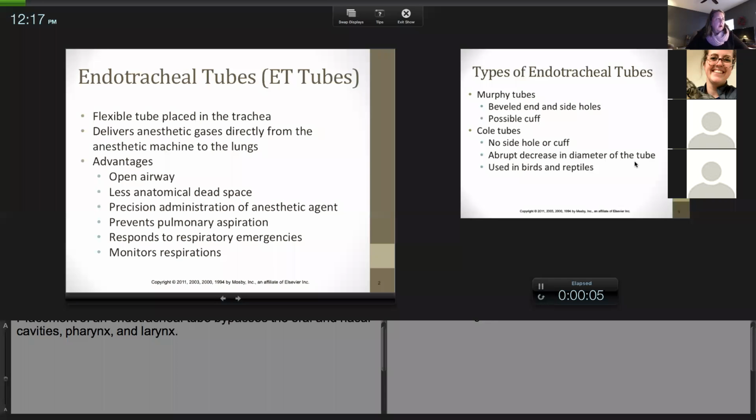Recording here. So if we talk about equipment, you break it down into pieces, like the endotracheal tube. The advantage of an endotracheal tube is obviously a more efficient delivery of anesthetic. And going back to my class, you can deliver oxygen and anesthetic via a mask and keep a patient asleep with just a mask. The disadvantage is exposure to personnel.